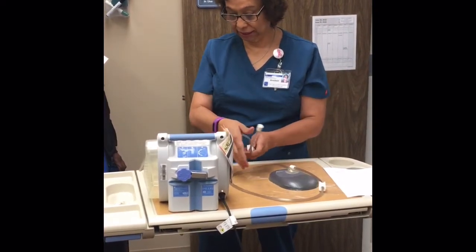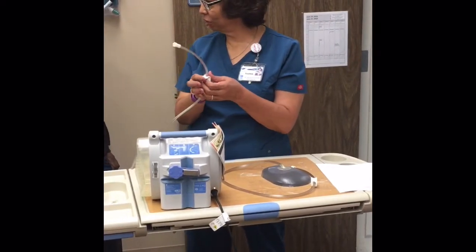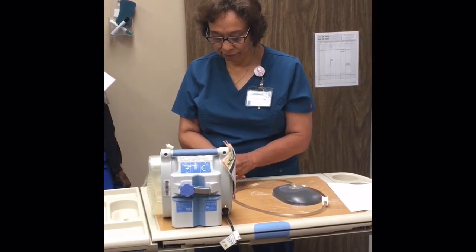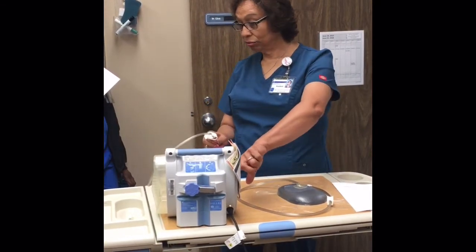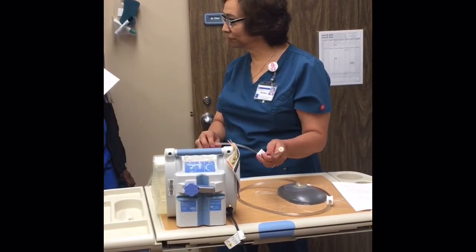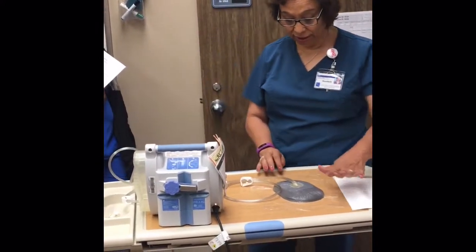And I'm going to leave it disconnected because this is how you can tell whether it's the unit or the dressing, okay? So I just have the hose clamped off. I'm going to restart my machine. And if a seal is indicated, which it's indicating that there's a seal, then your unit is not your problem, okay? So you're going to then come back, reconnect, open up the clamp, so you know the sponge is collapsed down.